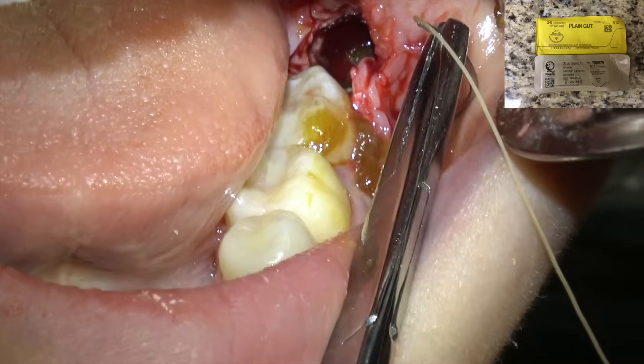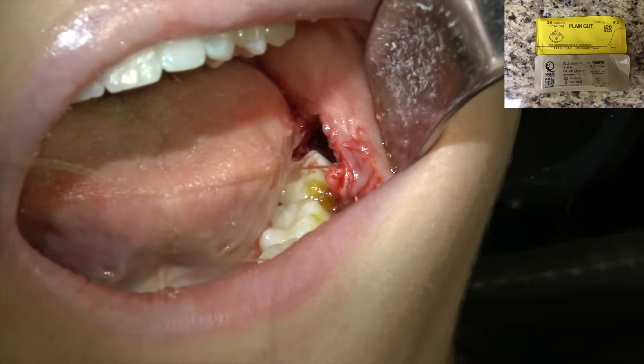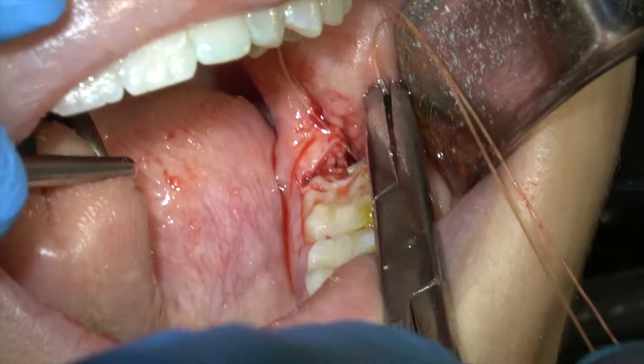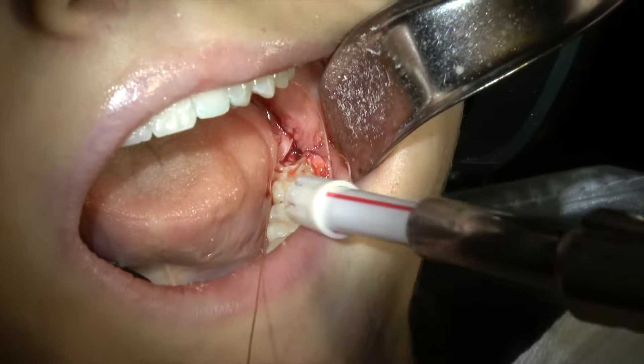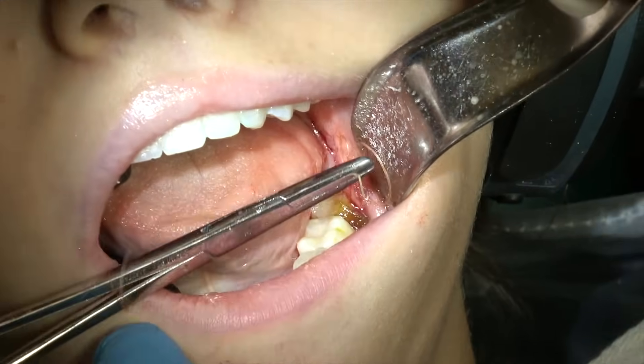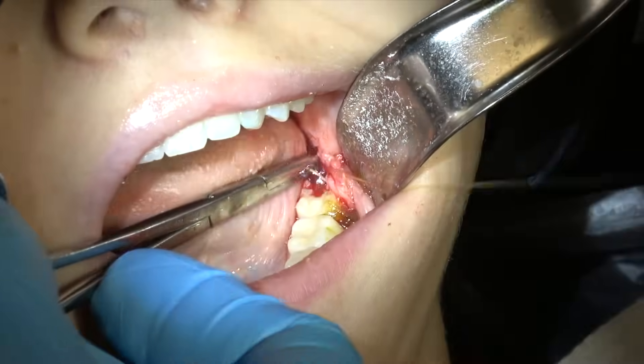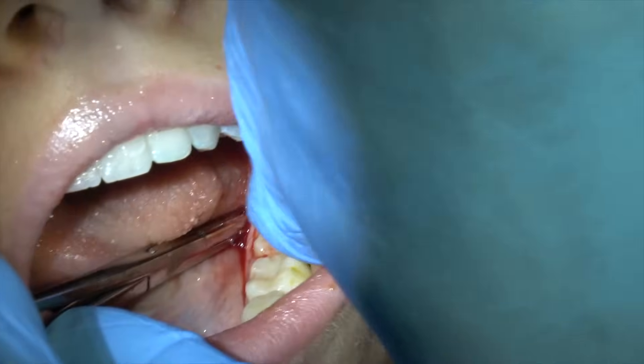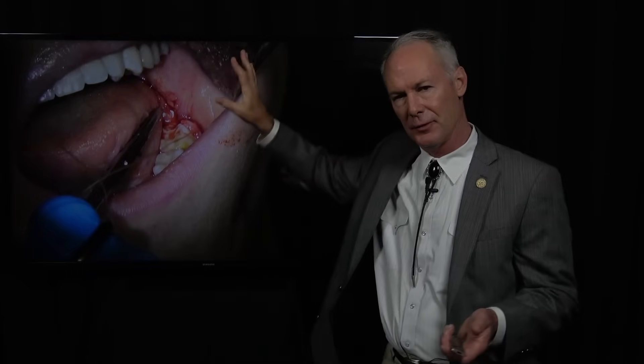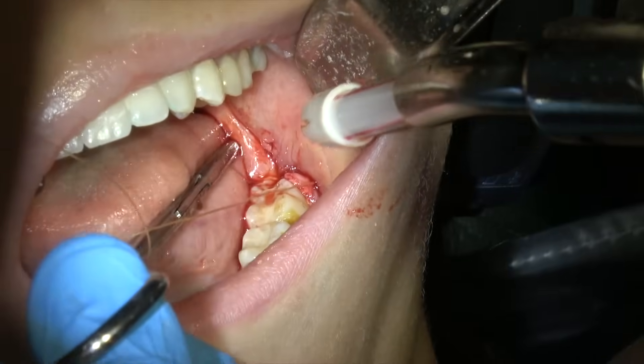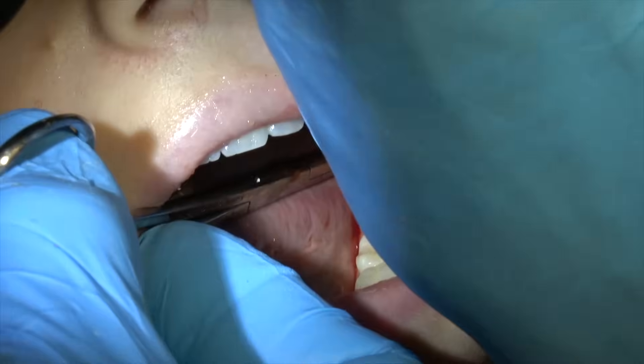Then you're going to suture it tight with 3-0 gut suture and take a big bite. Your first suture is going to be on the mesial part of the incision. And these sutures will dissolve in 3 to 7 days. Now 7 days is the key time for the connective tissue lining to reform in the socket. That's why you get a dry socket. Those nerve endings are exposed for 7 days. If you lose part of the socket, the nerve endings are exposed and they're hyper-hypersensitive. So if you pack the socket, you maintain the blood clot for 7 days and you don't get a dry socket. I'm suturing that tight.